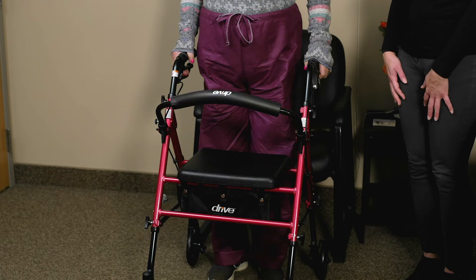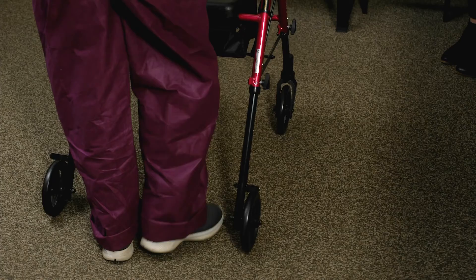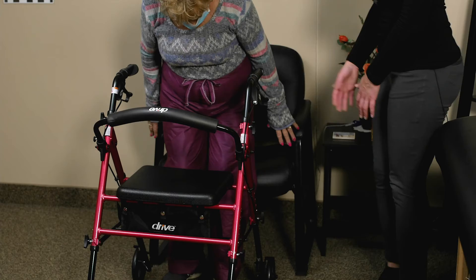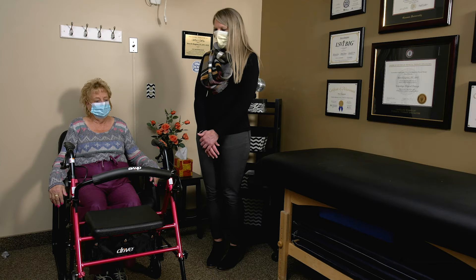Go ahead and unlock the brakes, walk forward a little bit, turn around, and come back. With these types of walkers, it's important to keep it nice and close to you, don't let it get too far away, and keep good posture — you don't want to hunch over when using it. When you sit back down, make sure both legs are up against the chair, lock the brakes, and reach your hands back to sit down. These walkers are nice because they give you a place to sit if you're walking a long distance and get tired.